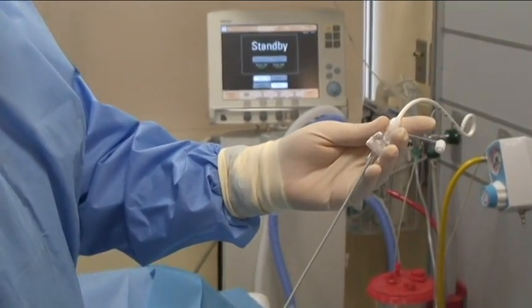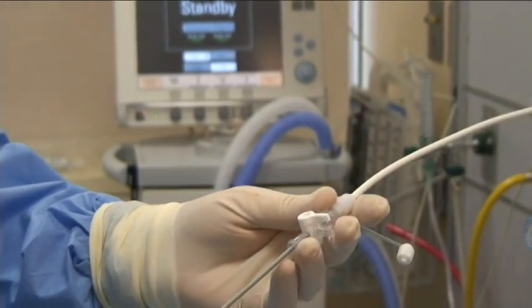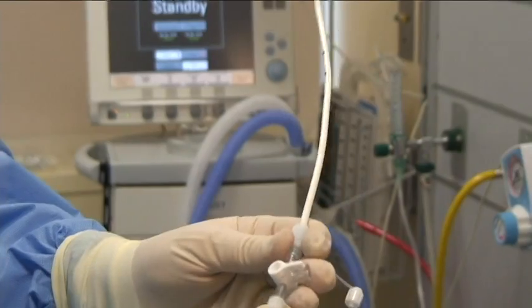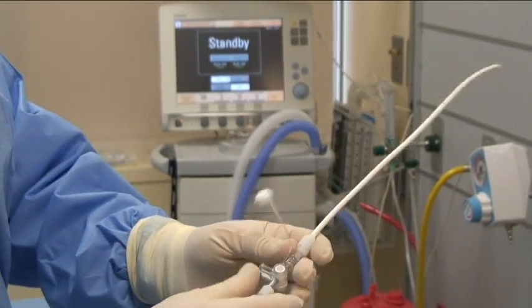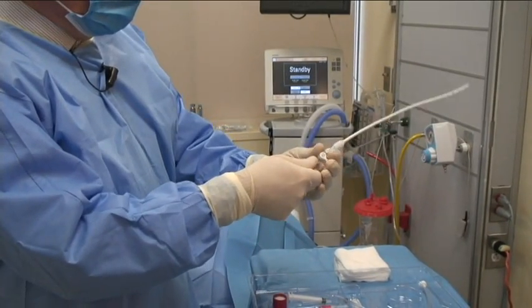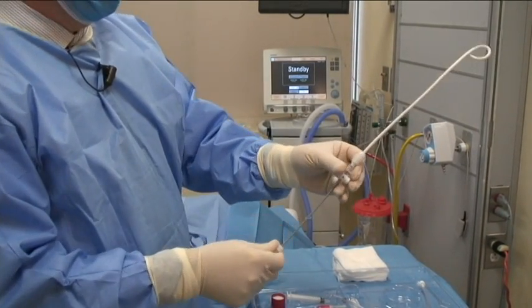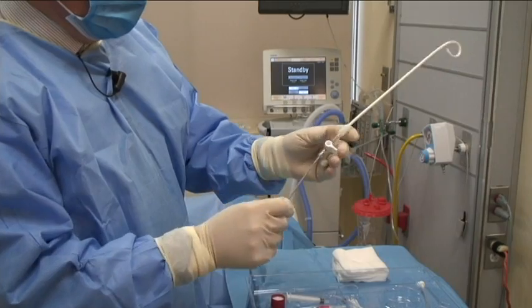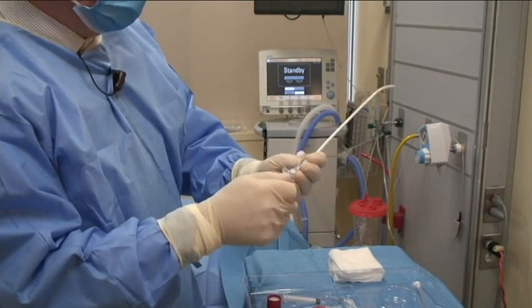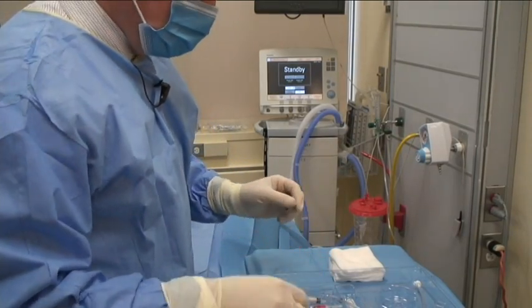So what I'm going to do is insert this trocar through the tube, which straightens it out for me, and then I can turn this to lock it. So we're ready. So now I have a straight catheter, and when the tube is in and I remove it, we're left with a curl. So for now, I'm going to leave it straightened out so that we are ready to use it when we're there.